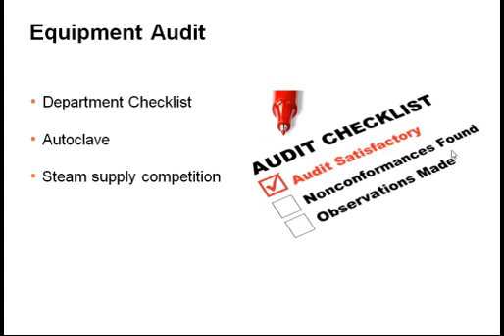When a new sterilizer is installed and a wet pack problem occurs, other areas need to be considered. Do not assume that it is a problem with the sterilizer. A question can be asked: are there any other pieces of equipment or areas requiring steam from the same steam source when the sterilizer is in operation? For example, the washer decontaminator, cart washer, kitchen equipment, and dishwashers.